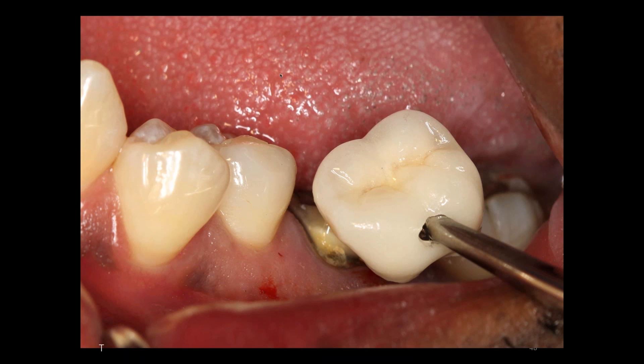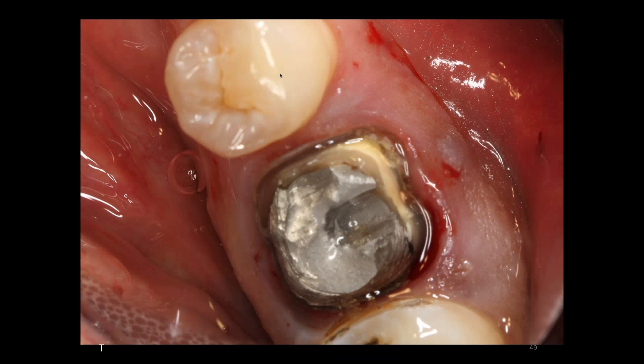Here we have a tooth that is non-restorable, and removing a fractured molar with divergent roots can be challenging.